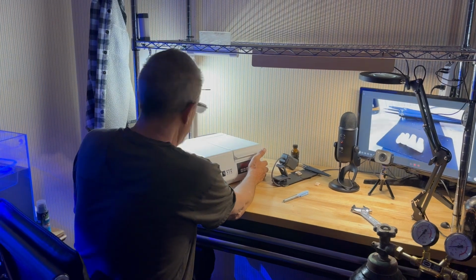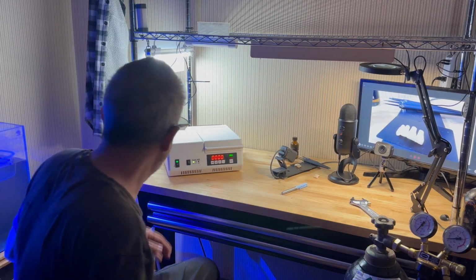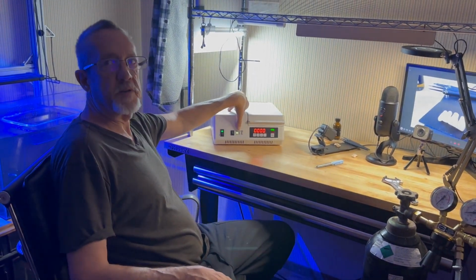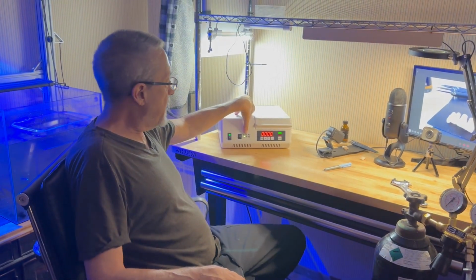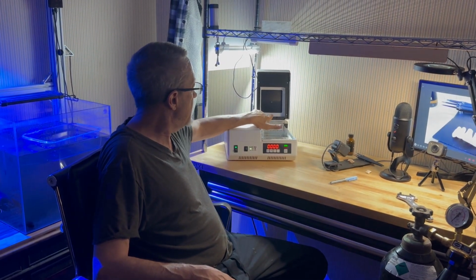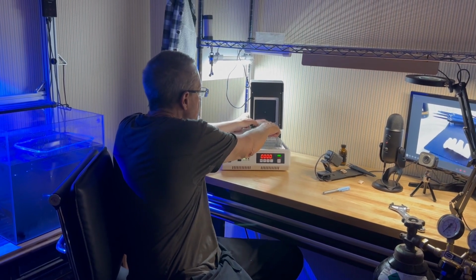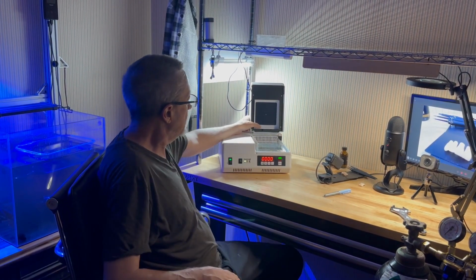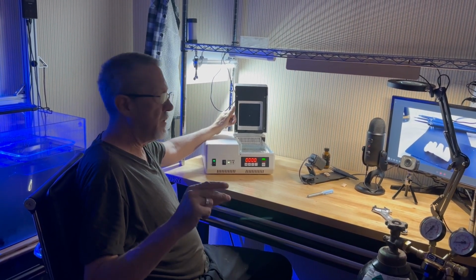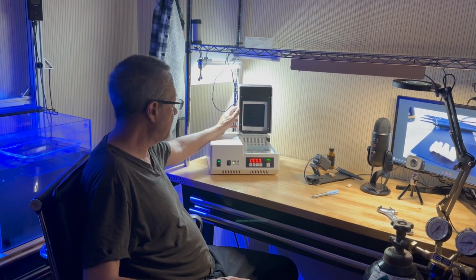All right, like I said, I've lowered the bar on that below what it wants you to have. First of all, switch all the way up. That is gas on for 90 seconds. Basically, gas is going to turn on and purge your chamber. This is actually a seal. You might read online that this does not have a seal. It does. It just has a white neoprene seal, but it does seal. It will purge the gas for a minute, and then your flashes will start, and it'll continue purging gas for another 90 seconds.